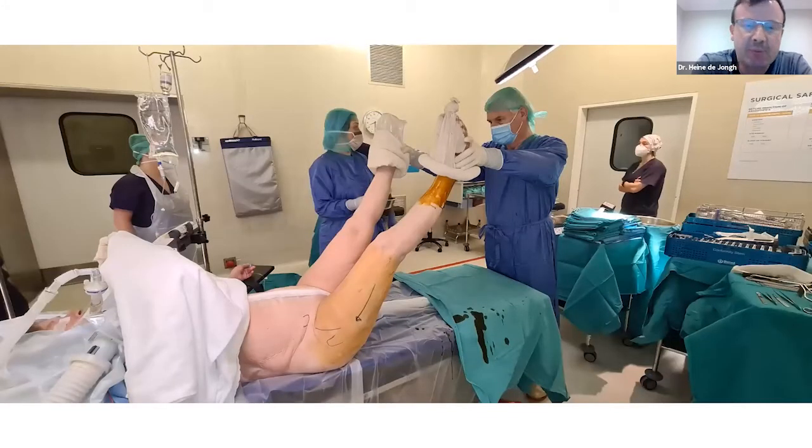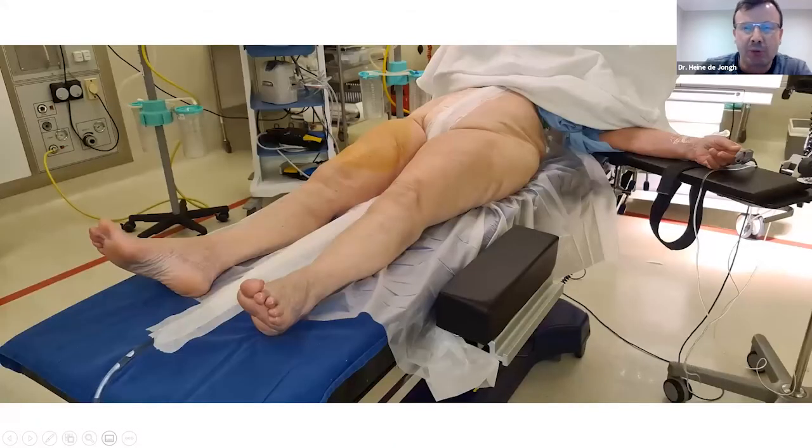This is a theatre setup. I suppose it takes a bit longer than the traction table, I would say 5 to 10 minutes. We clean the operating side, and we only clean on the contralateral side, the proximal area. I use one assistant. He needs to be there a bit earlier to help with the cleaning. Our bolsters, the only addition is this extension on the contralateral side, right about knee height. I will show you later where I use that.